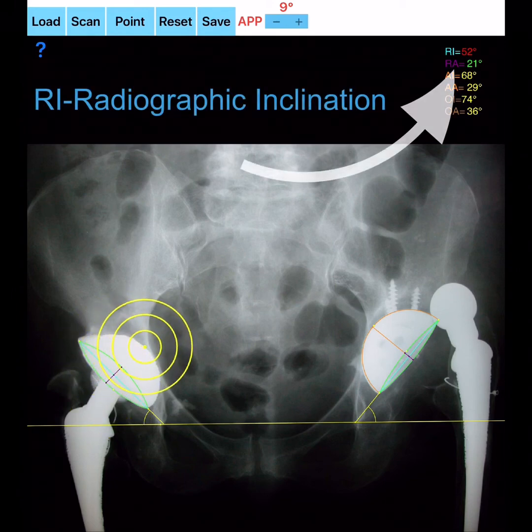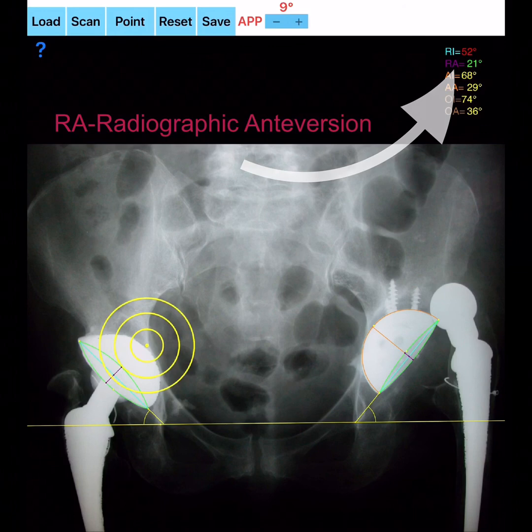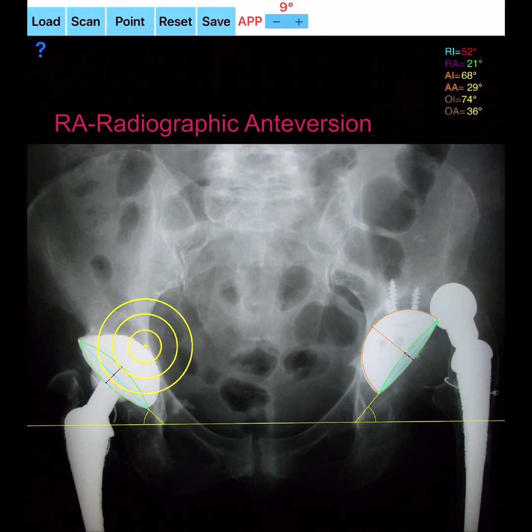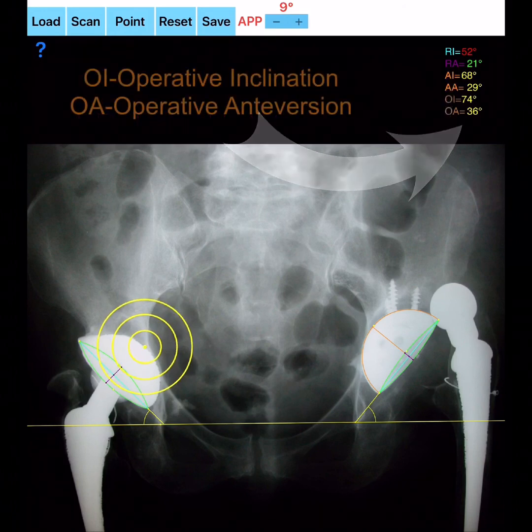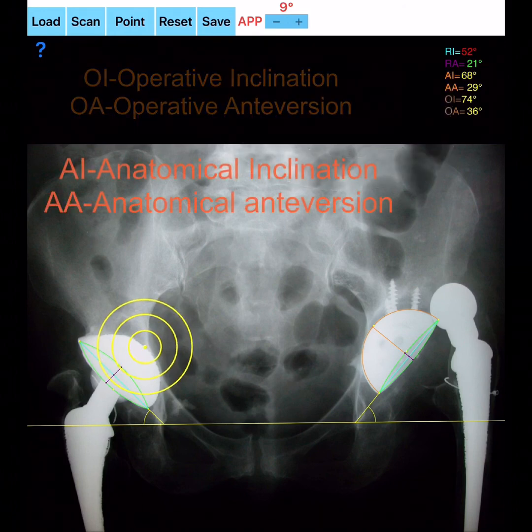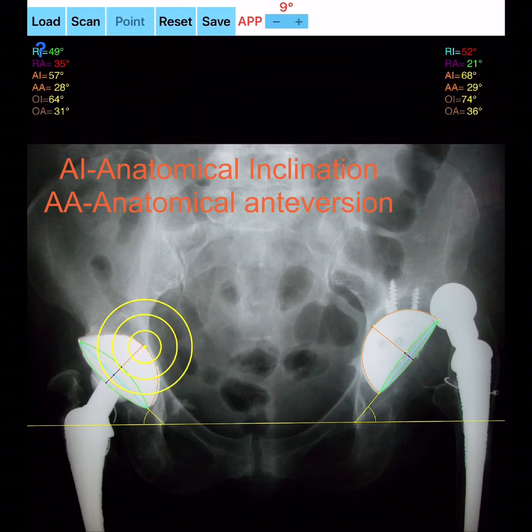Screen readings include: RI (radiographic inclination), RA (radiographic anteversion), OI (operative inclination), OA (operative anteversion), AI (anatomical inclination), and AA (anatomical anteversion).